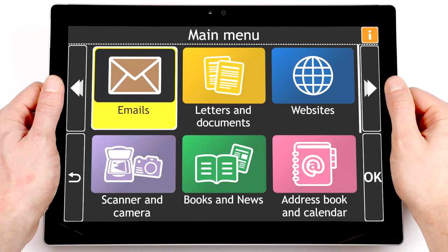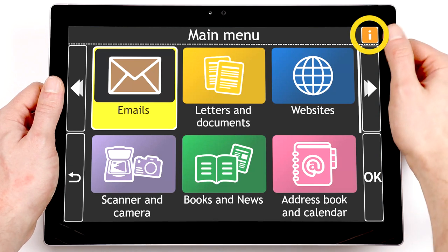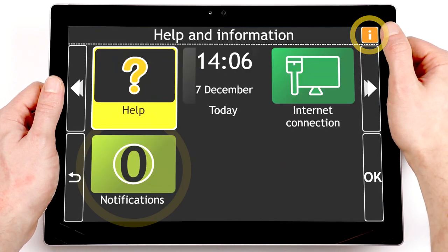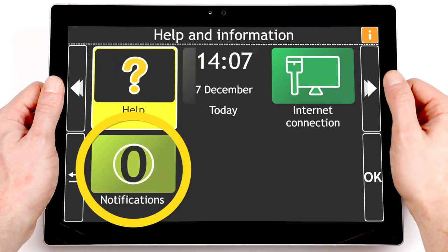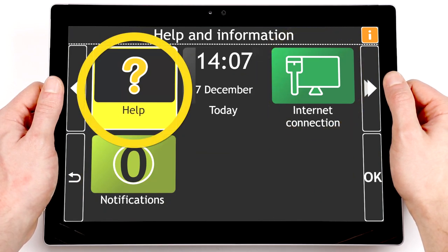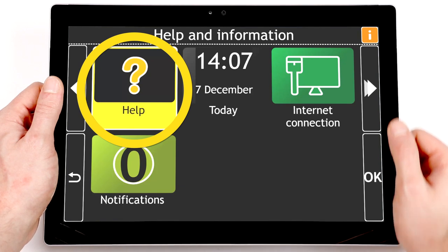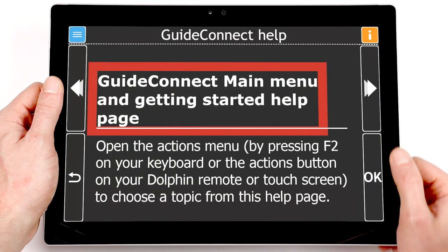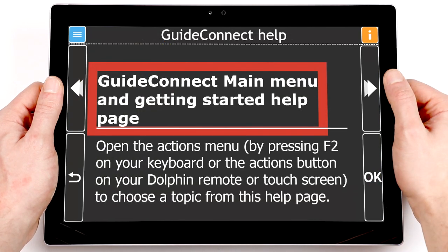Tap the yellow button at the top right corner for help and information about your device, such as notifications, whether you're connected to the internet, and more. Select the first item in the menu, which is called Help, to open Help for the feature you are using.